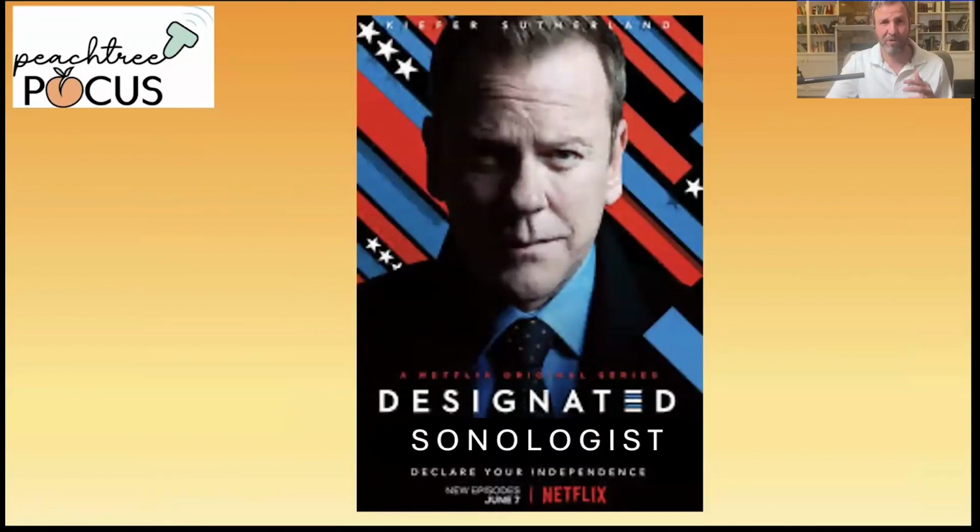If you have enough people in the room, and I recognize that a lot of you may work where you're the only physician or clinician around, so this is specifically if you work somewhere with a lot of people, you want one person to focus solely on following the ultrasound algorithm. That way, the team leader can focus on running the code while the sonologist can feed back findings quickly and clearly as part of the overall team.